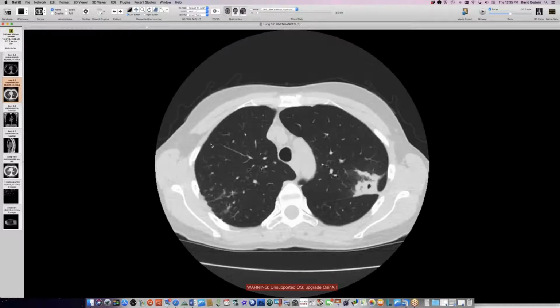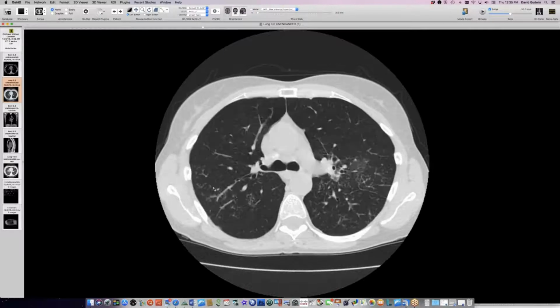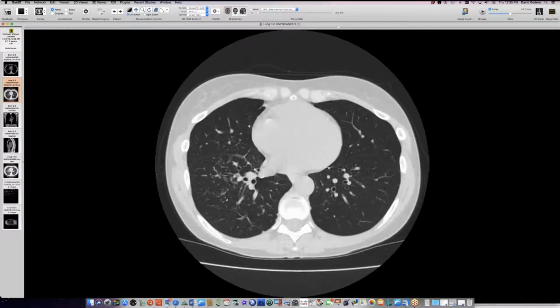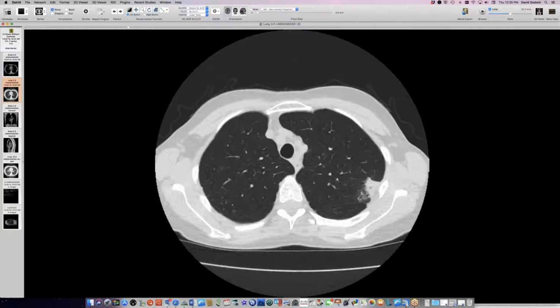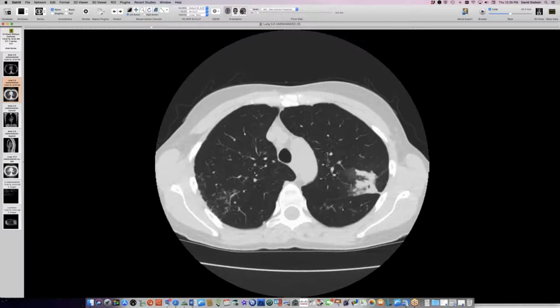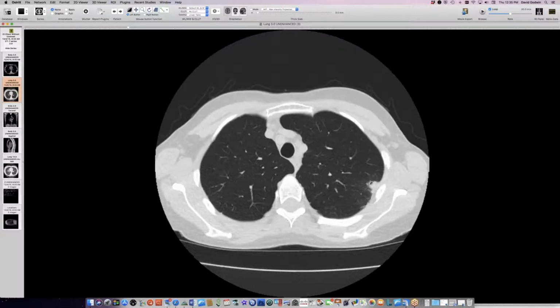Okay, now this person has a lacy pattern of small nodules here, both sides, mid-lung predominant, tapering off to the bases, and then had this larger lesion here in the left apex, left upper lobe, sitting along the fissure with cavitation. This was resected, and they recovered necrotizing granulomas from it. And this is all in the setting of sarcoidosis. So here's sarcoid with a necrotizing component here.